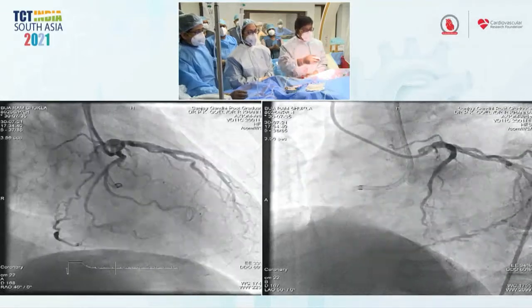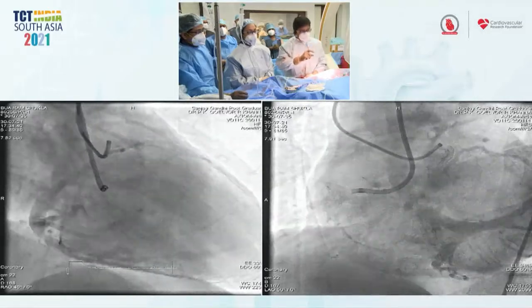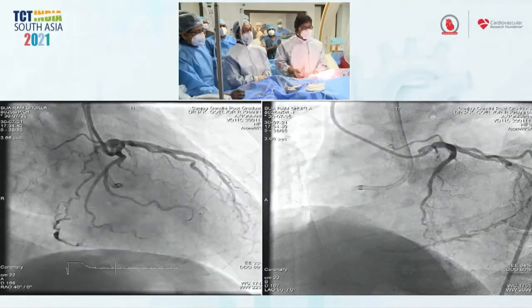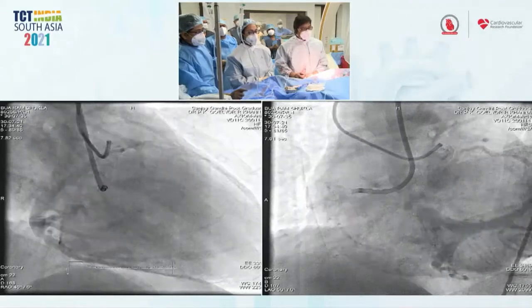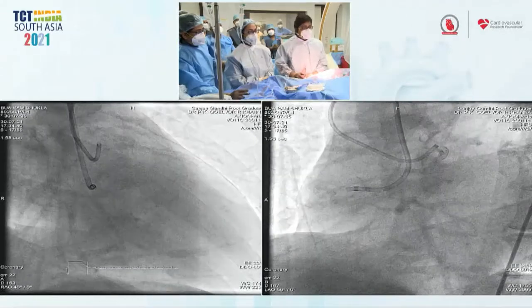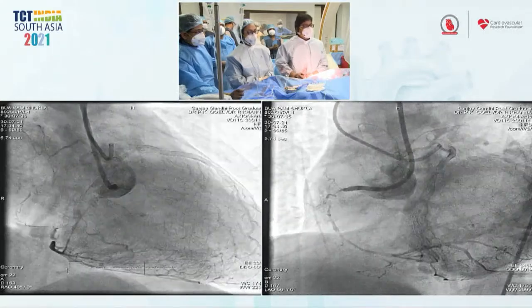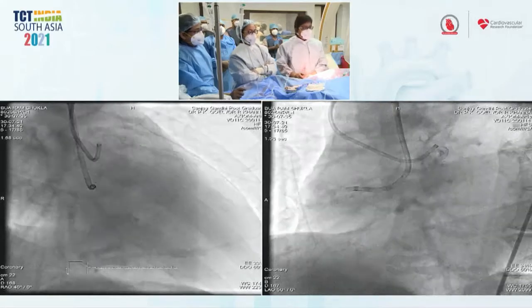ADR is a good option because the distal vessel is good size. So let us see what happens, because the occlusion total length is about 20 millimeters. It is not too long. I have a feeling that we might succeed antegrade itself. Otherwise, we have both options for retrograde. I think we will prefer the septal to the epicardial retrograde. Okay, let's get started.